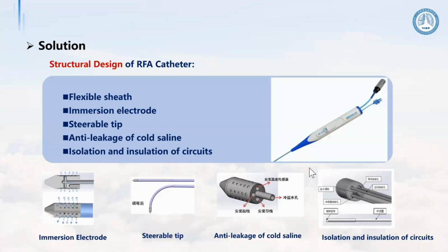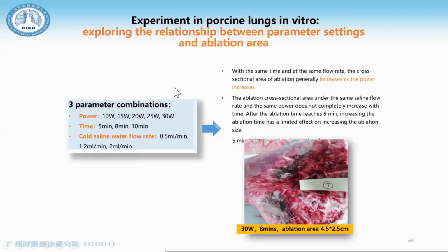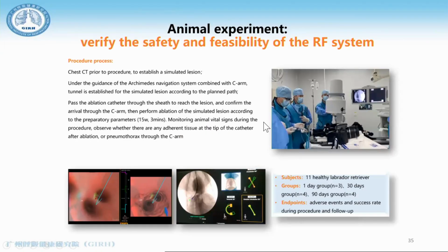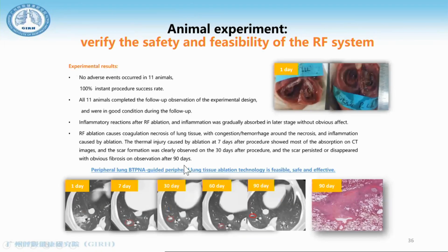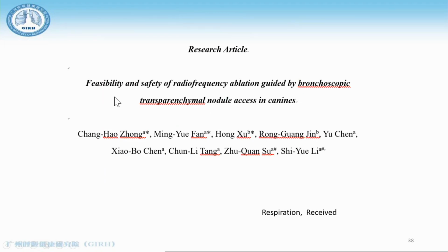Here is the structure. We did an overall study and an in vitro study, and here is the 3-month data. We also did the dose and effect area curve, and this work was published in Respiration.